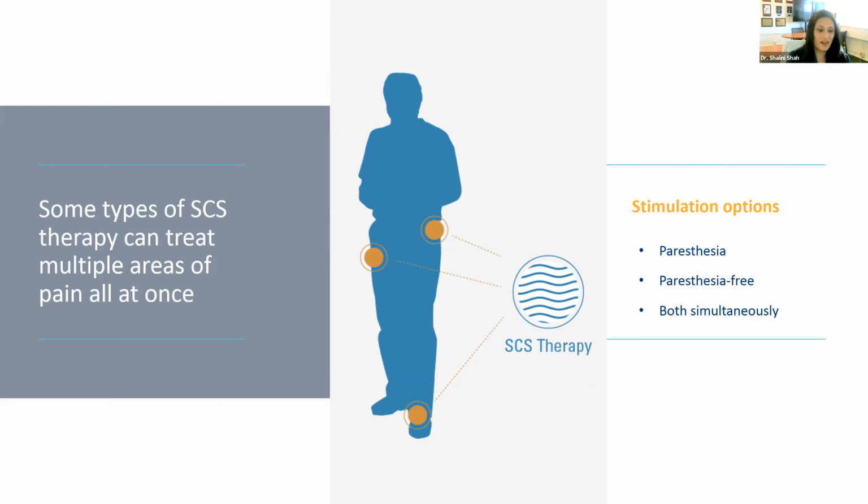We can build in 5, 7, 10 programs for you to play with. You can turn it up. You can turn it down. On those days where you're saying, I'm not doing much at home, I can relax, I probably don't need it, you can even turn it off. Those batteries are rechargeable and they'll last for 6 to 8 years, depending on your manufacturer and depending on how much you charge. So again, it's a durable medical equipment that's going to be implanted. And if you like both, you say one day I want to feel the paresthesias, the vibrations, and another day I don't, you don't need to. So it's up to you. It's completely personalized medicine.